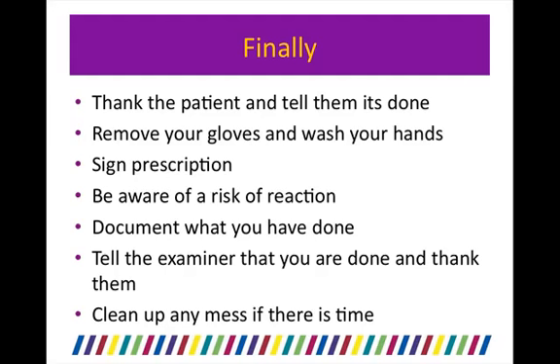When you're done, thank the patient and tell them it's over, remove your gloves and wash your hands, sign the prescription form, be aware of the risk of antibiotic reaction, document what you've done and tell the examiner that you've done and thank them. If there's time at the station, clean up any mess.